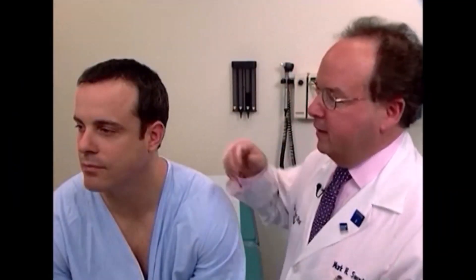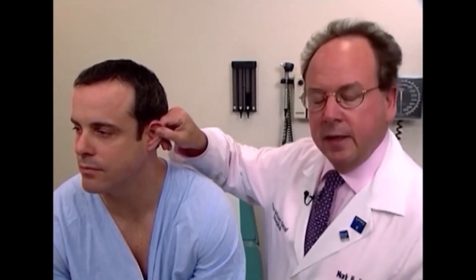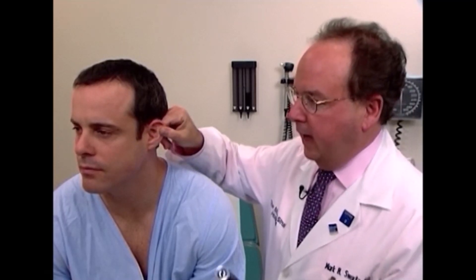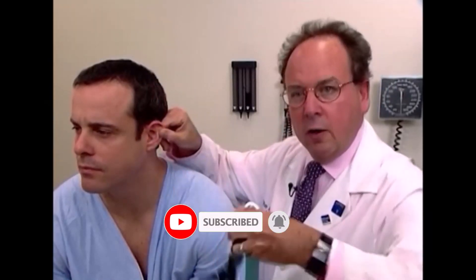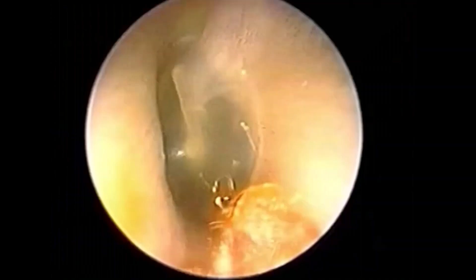To examine the left ear, the examiner uses his or her right hand to pull on the tragus and earlobe up, out, and back. The otoscope can be entered into the external canal as demonstrated on the other ear, or held in this manner. The speculum is inserted as demonstrated now.